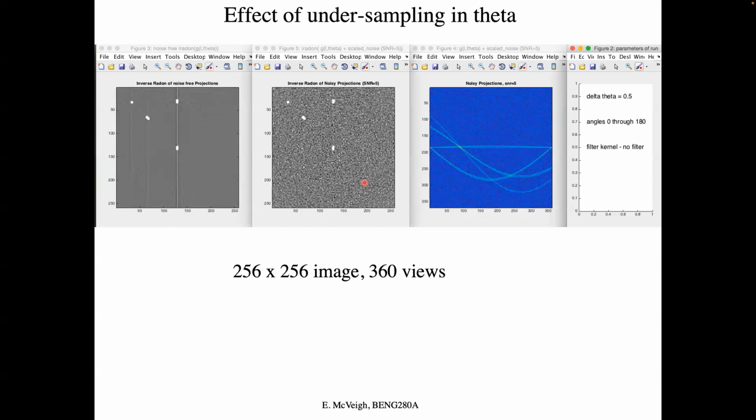If you wanted to keep cranking the mA up, you could get to a reasonable number of photons in each view, but then you're using more dose. Signal to noise of the picture would be beautiful, right? But do you need it? The other thing is, eventually, when you add 2 more views, your resolution will not change, because your resolution is fundamentally limited by the size of the X-ray spot and by the dimension of the detector element itself.